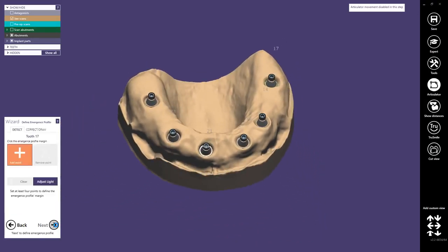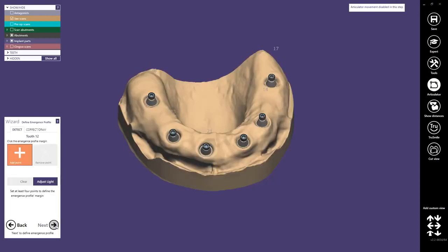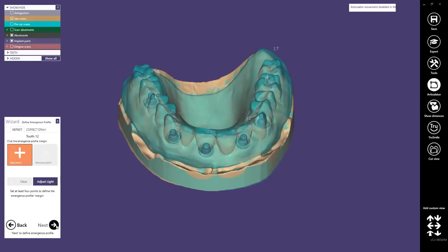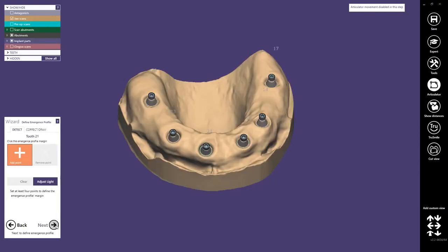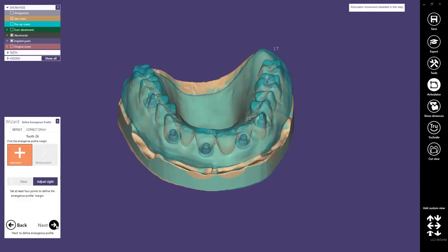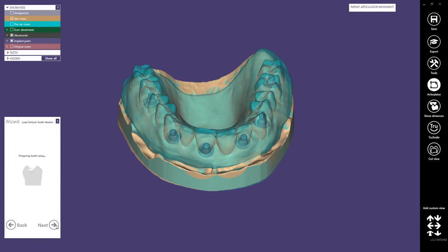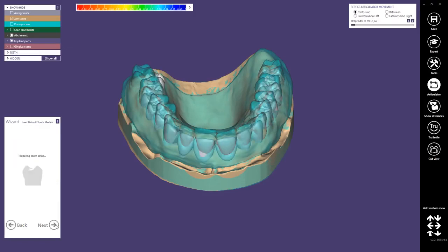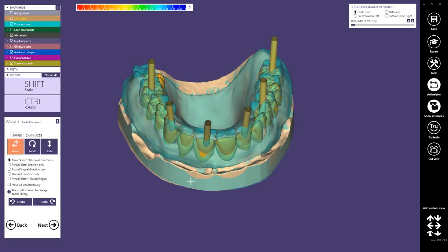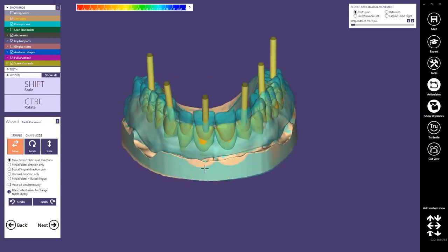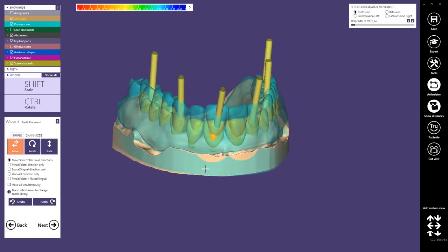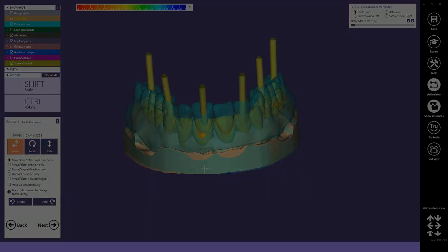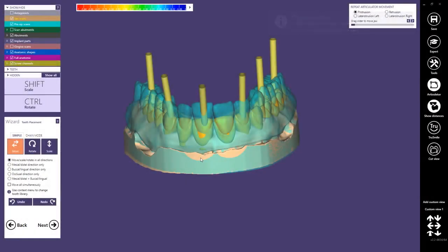In this step we can define the emergence profiles. I will skip this here because I don't want to design individual emergence profiles on each tooth. In the next step I'll show you how to design a circular emergence profile, which is the shape I'd recommend for this kind of restoration. First of all we'll do the tooth placement. In a first step we'll do functional tooth placement using the pre-op, and later we'll use smile design to do an aesthetical tooth placement of the anteriors.